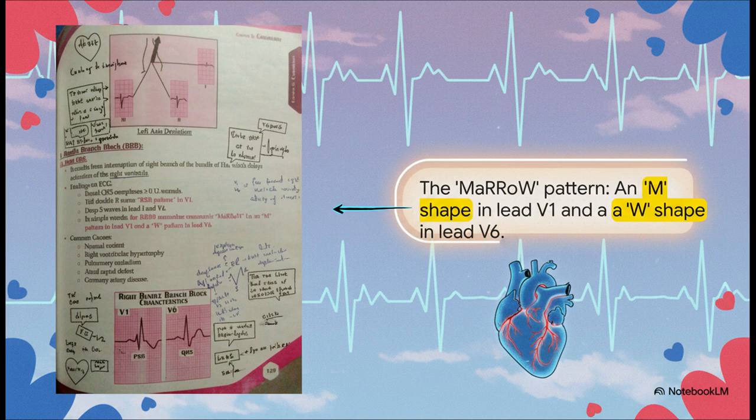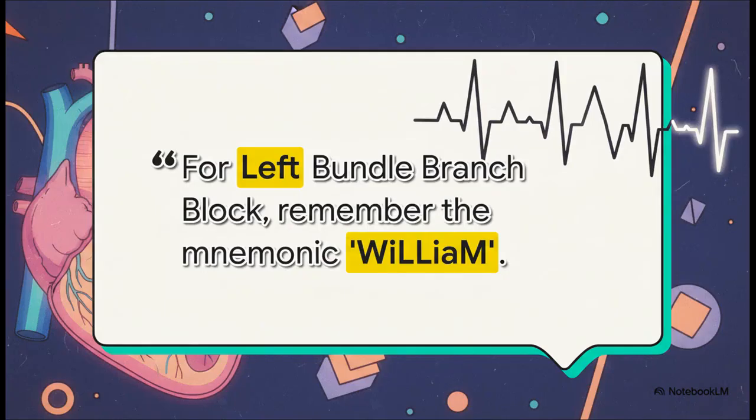Can you see it on the slide? It's like a secret code. Once you know what you're looking for, it just pops right out at you. Okay, so what about a block on the left side? Well, of course, there's a mnemonic for that too: William.